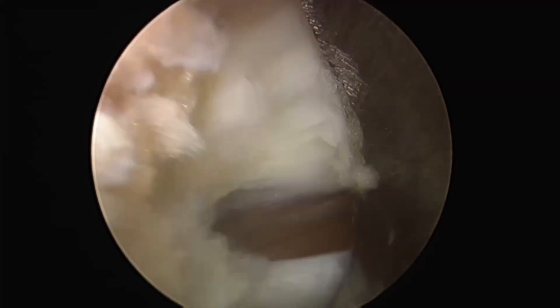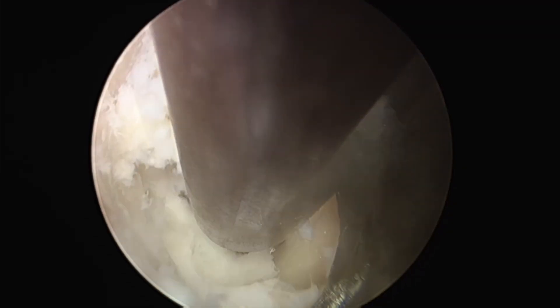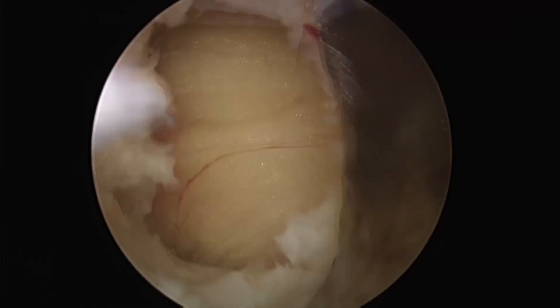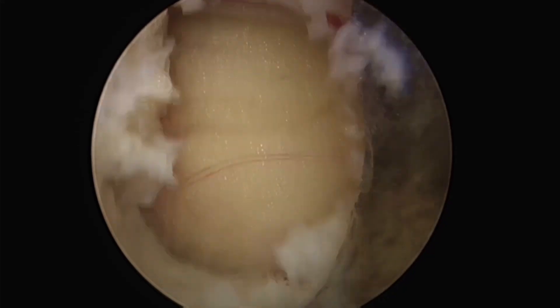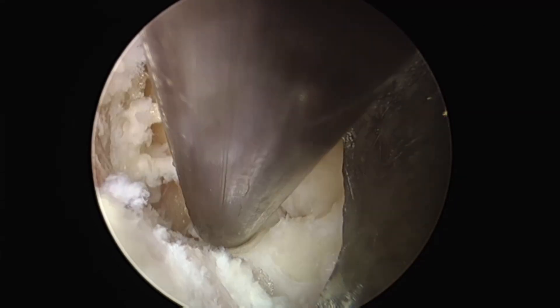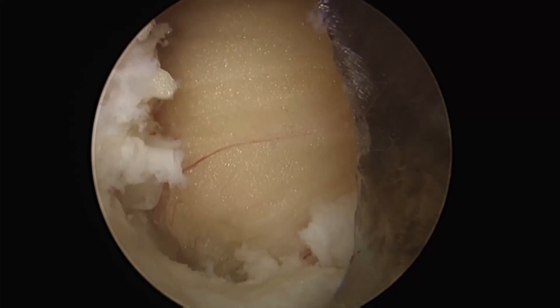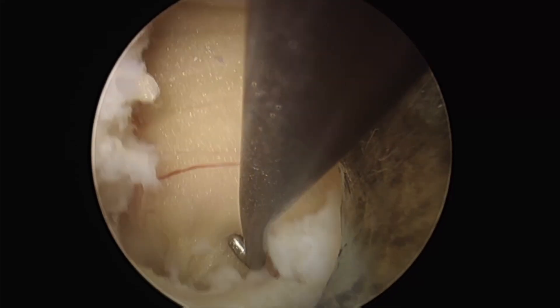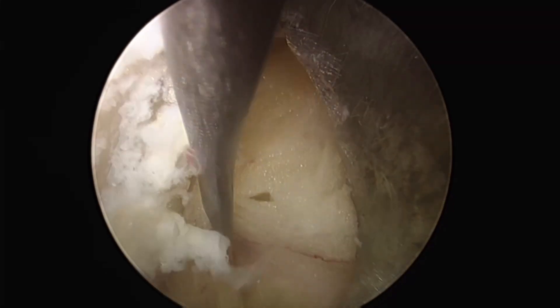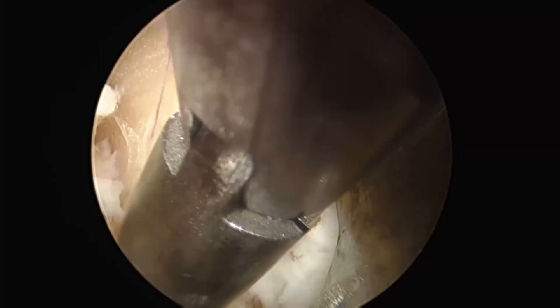The ligamentum flavum is removed up to the attachment of the superior articular process, and the resection is performed until the lateral aspect of the root is visible. If pre-thinning of the superior articular process by drilling has been done, it becomes possible to remove it with the Kerrison long jaw even when the lateral aspect of the root is difficult to see. There is fat above the drill; hooking it with a hook allows the surface of the root to be easily seen with water irrigation.